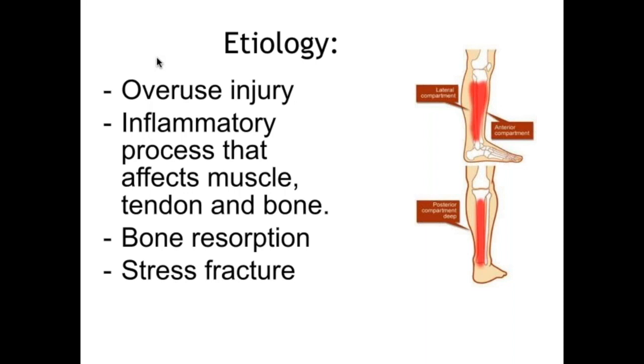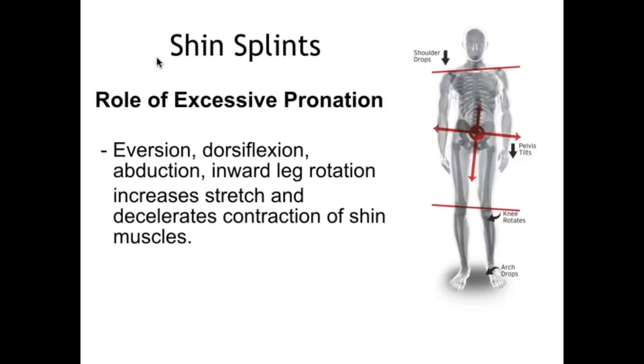We can see the biomechanical ramifications of this. The feet are rolling in, they're dropping, the arches have fallen, they create the internal rotation of the tibia and femur, as you felt earlier when I had you stand up. And then we use our laser over the shin bones to get that muscle to calm down while we adjust the ankle, the foot, and the knee, and we support and we take away the cause of that stress, all right? Excessive pronation is absolutely part of this whole thing, all right? It is. I can't tell you how many times I've seen this in people. So you got to check those feet and the ankles and the knees.